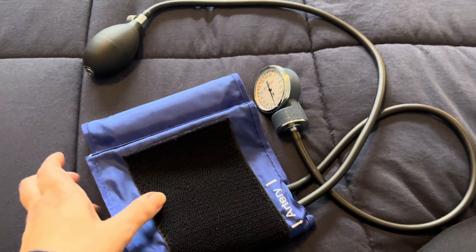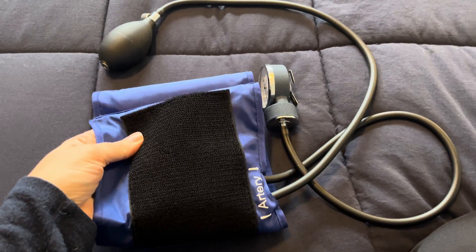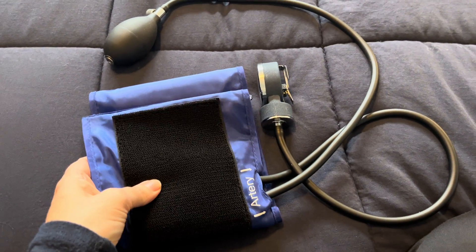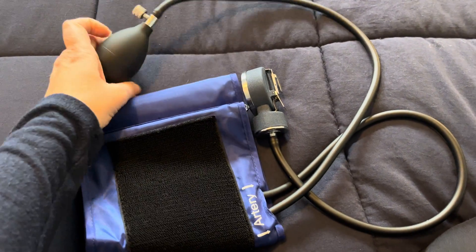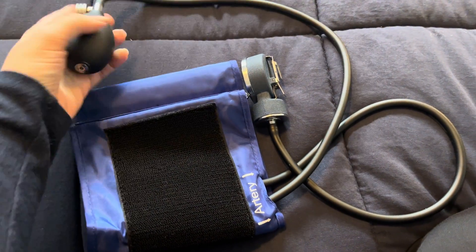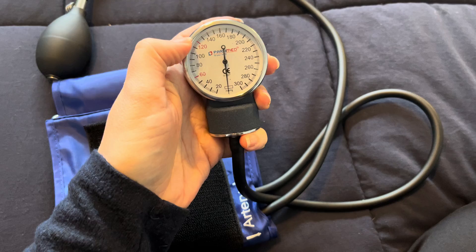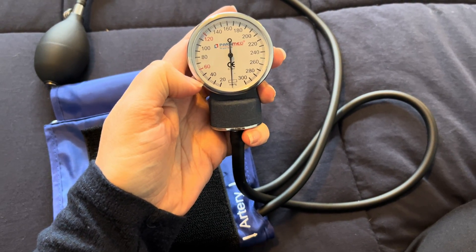What I really liked about this is it's very adjustable to fit just about every size arm. The artery is really well labeled, so for a beginner that's helpful, and the pump is easy to open and shut. The reader is really easy to follow and there are all the extra ticks so you know exactly where it's starting and stopping.